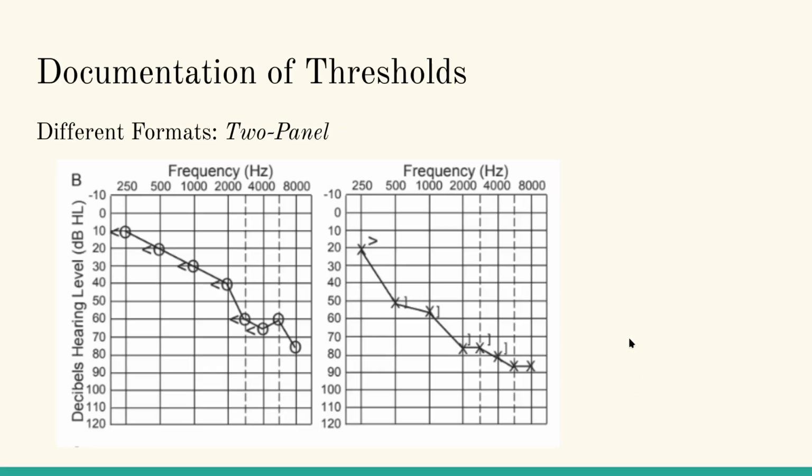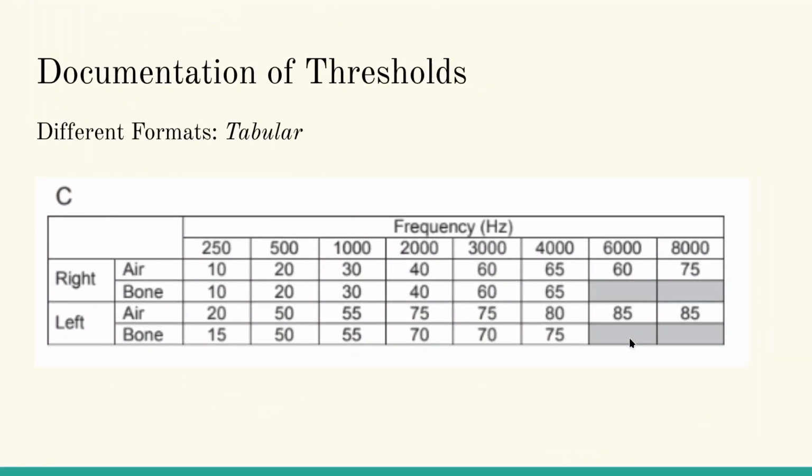You have a third way you can present audiometric data. You have tabular information here, so you're looking at it strictly in numerical format in a tabular chart. This is mainly used by the VA. I'm not a big fan of that, but I didn't work at the VA for very long. I never got really used to seeing audiograms in tabular form, but the VA absolutely uses audiogram data in tabular form. I'm sure once you get used to it, it becomes a little more familiar.